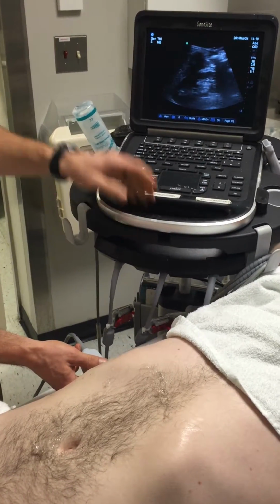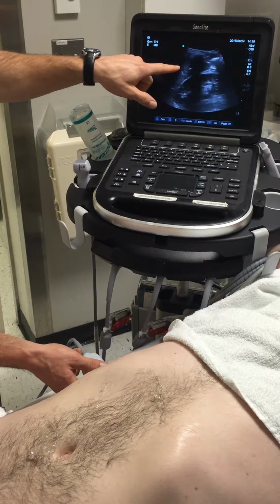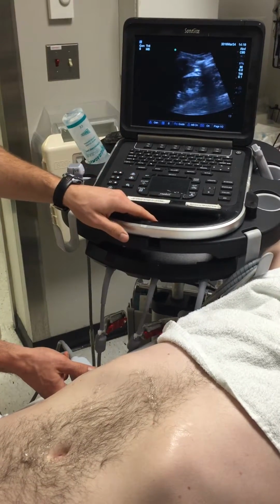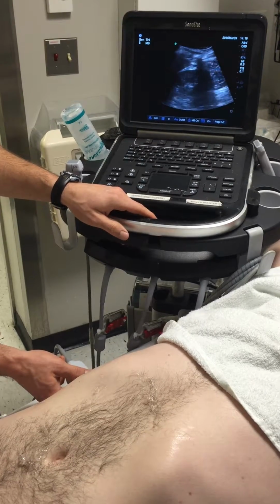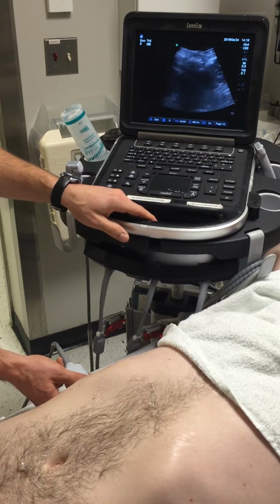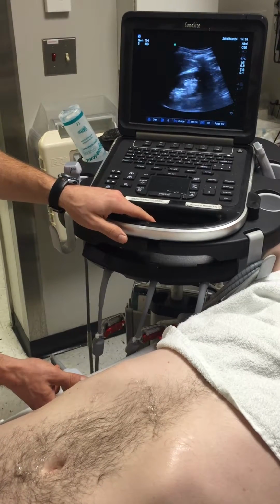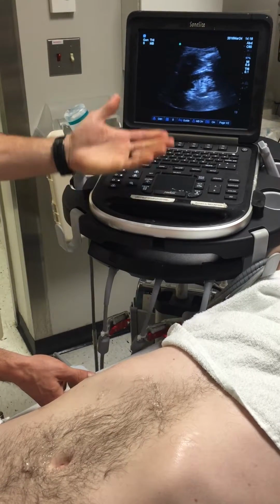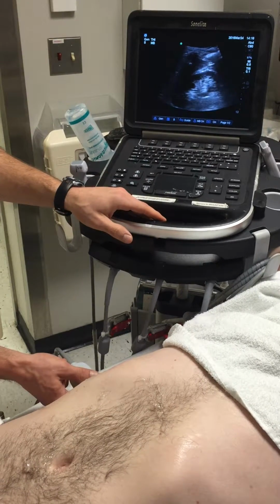And you can see the liver here, which is a great echogenic window. And you can see the cortex of the kidney here. Try your best to center the image. And like any organ, you want to fan through it all the way, and you're looking typically for hydronephrosis. You can see cysts, and you can see kidney stones as well. Those are more common things we look for in the ER.